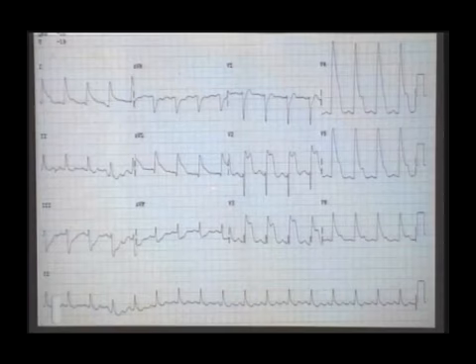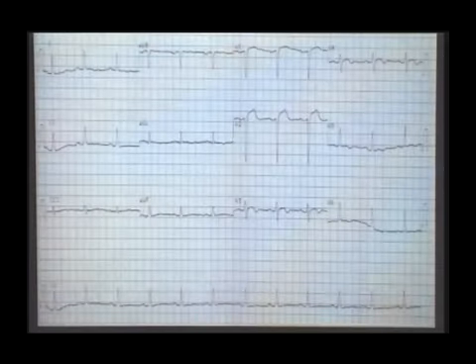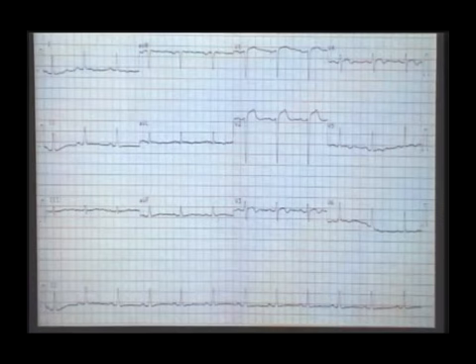So you can see that huge ST elevation MI. What's happening here? The huge ST elevation here, V1 to V6, L1 and AVL. That is the entire anterior wall, interventricular septum, anterolateral wall, high lateral wall are injured. That is, the entire left ventricular myocardium is going to die in this patient. But at this point in time, see the R wave there. That means at this point in time, there is no infarct. So you thrombolyze the patient within 30 minutes or 15 minutes of entry into the hospital.